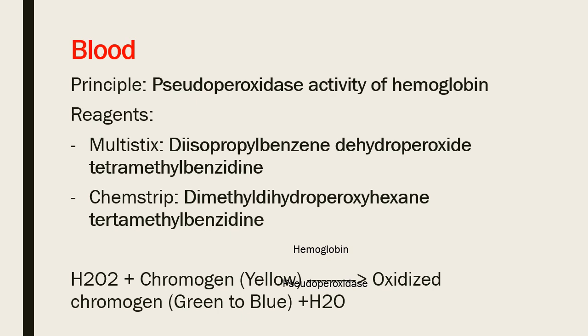Then you have your blood. The principle employed is the pseudoperoxidase activity of hemoglobin. The reagents used for your multi-sticks are diisopropylbenzene dihydroperoxide and tetramethylbenzidine.